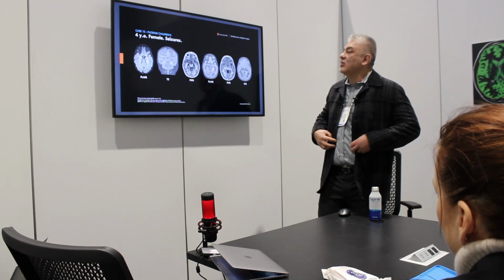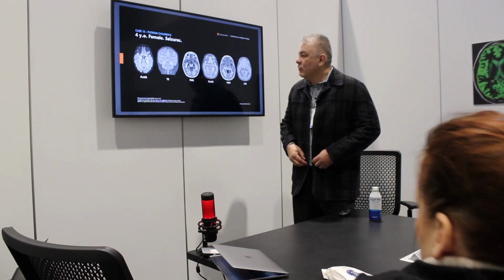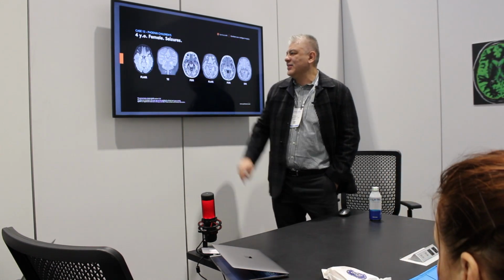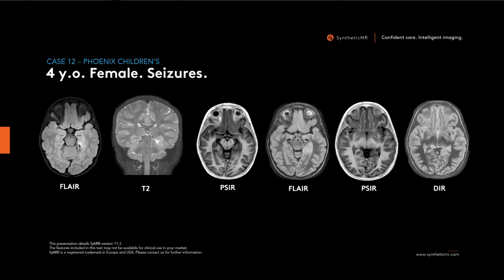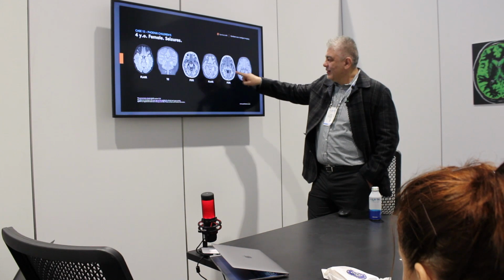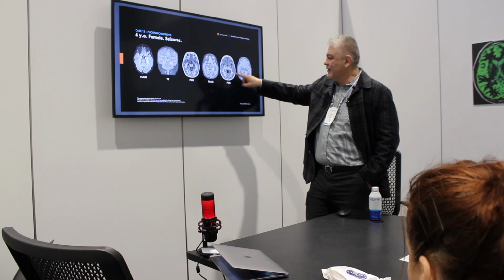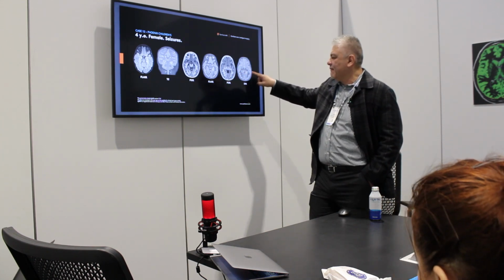So, another case of seizures, like we see a lot of seizures, it helps me a lot. So we see this case, obviously same thing, mesial temporal sclerosis, the temporal looks like there is something going on here, right, low on T1, high on T2, on the medial temporal lobe. That's the obvious, everybody saw that. But nobody saw this. Look at the cortex here. That cortex is abnormal. Compared to the cortex on the other side, it's significantly abnormal, and bright in the double IR.